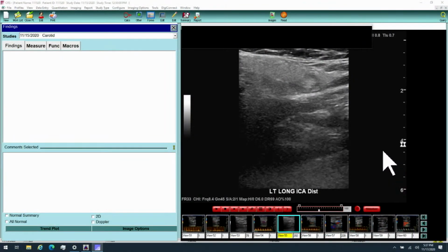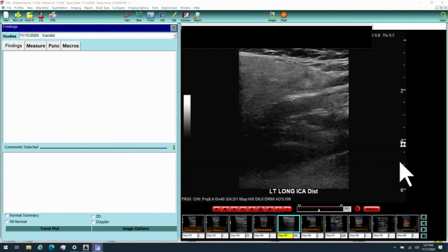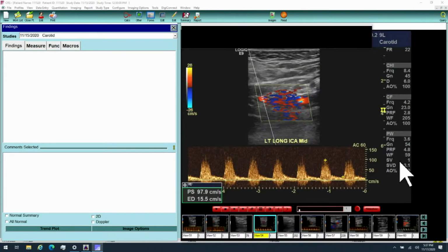Looking at the trajectory, it's hard to see, but so far we're in the ICA. Go back to the waveform. Okay, so here's what you are telling me with the label. I'm buying it because I did not see any branches, and by sizing it looks to me like an ICA size vessel. By labels and by the waveforms, maybe a little bit too high resistance for an ICA. Those are the things that kick in when you go back and try to analyze everything.